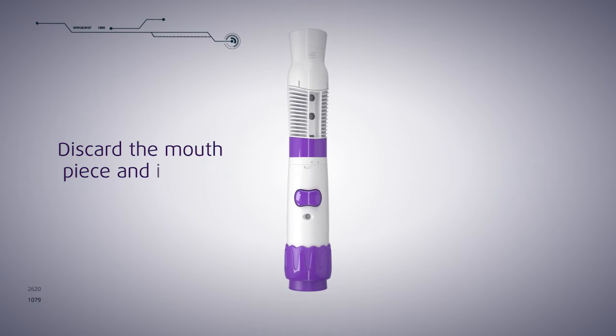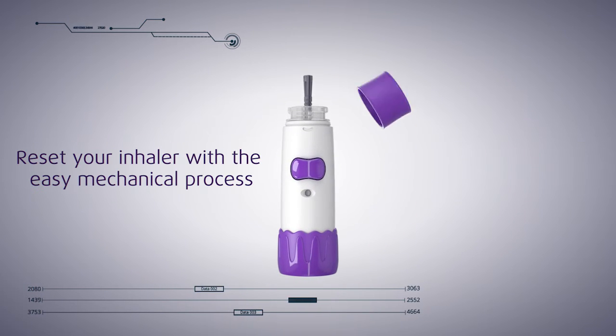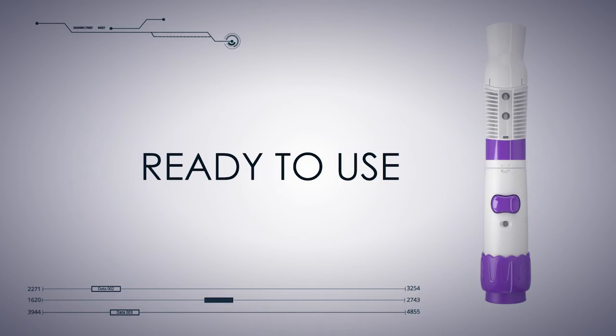When the inhalation is completed, you just have to disassemble and discard the mouthpiece in a suitable container and reset your inhaler using the easy mechanical process. No plugs, no wires, no batteries, no nonsense.